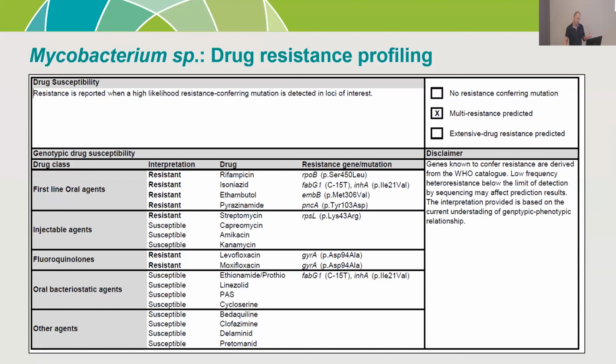And this is really just an example to show you what their drug resistance profiling reports look like. So rather than the bacteriology lab looking for entire genes, most often we're looking for just resistance causing mutations. So again, using single nucleotide polymorphism variants to predict what the resistance profile will look like. And this will allow the lab to send out these reports much, much earlier than they would have ever been able to using the traditional culture-based methodologies.